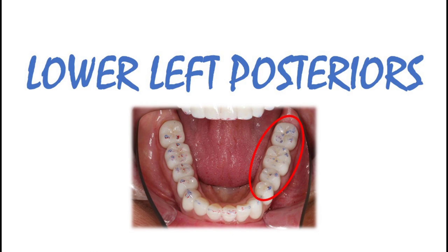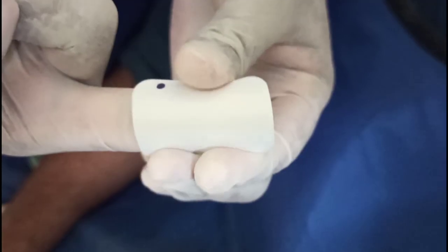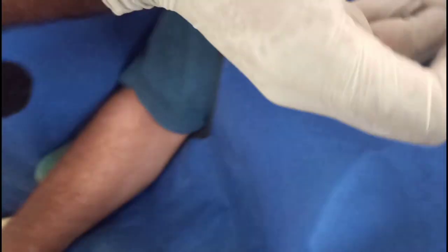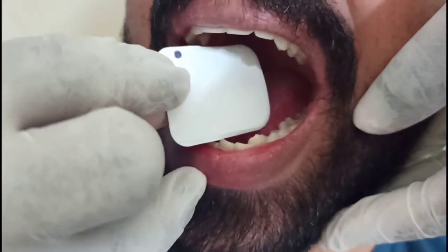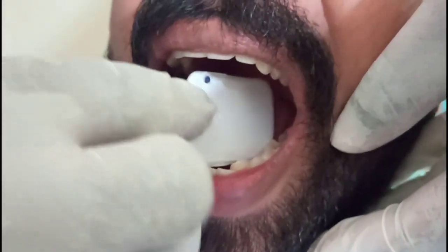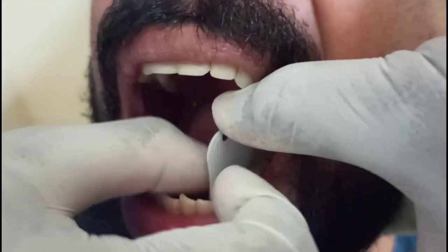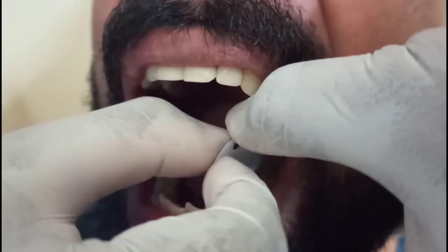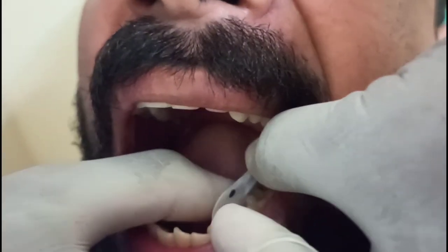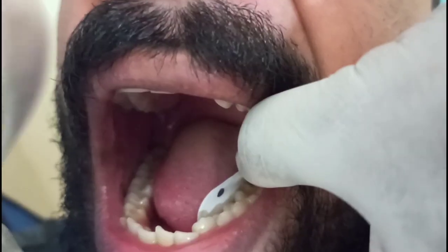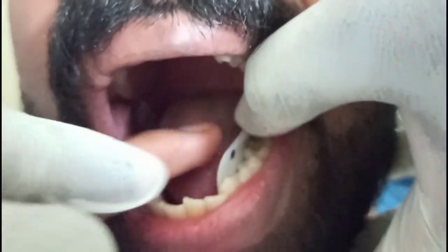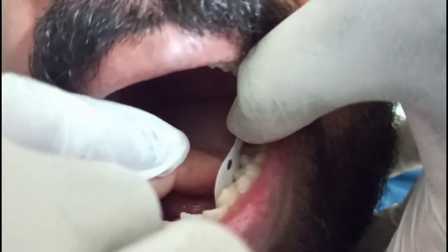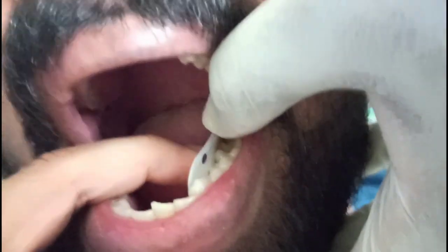For lower left posteriors: note that I am standing in the nine o'clock position with my left hand to the left side of the patient going around his head. I am placing the film inside with my right hand and then holding it with my left hand thumb on top of the film until the patient takes over to hold it.